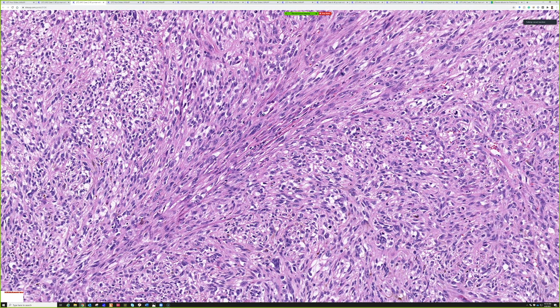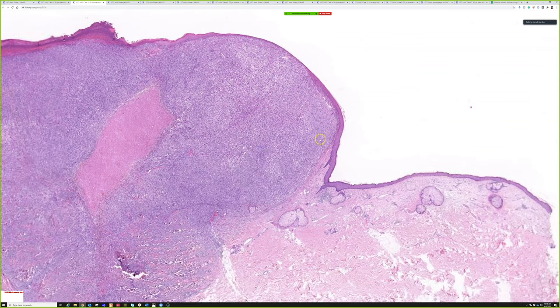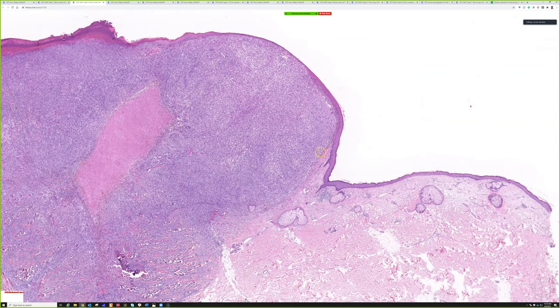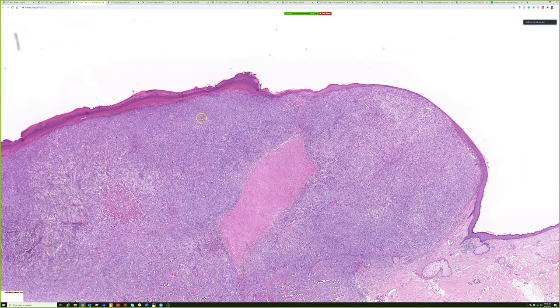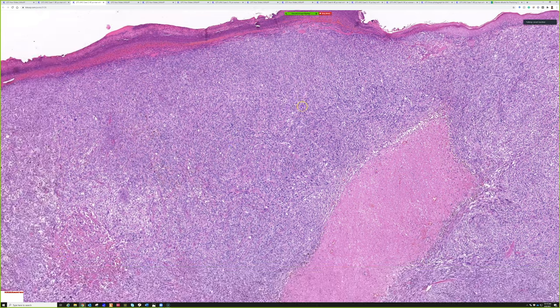Spindle cell angiosarcoma can occasionally be really cellular and lack vascular channels. On a bigger specimen, spindle cell or epithelial angiosarcoma will often show infiltrating channels at the edges, but on a small sample it can be very difficult. That's why I usually include ERG or CD31 in my panel when evaluating a malignant-looking spindle cell tumor of the skin. Angiosarcoma is such a bad disease requiring specialized management that I definitely want to make sure I don't miss it.